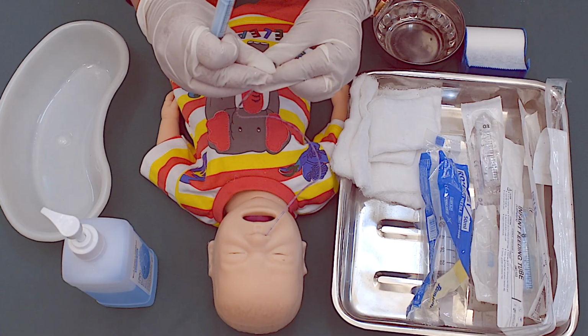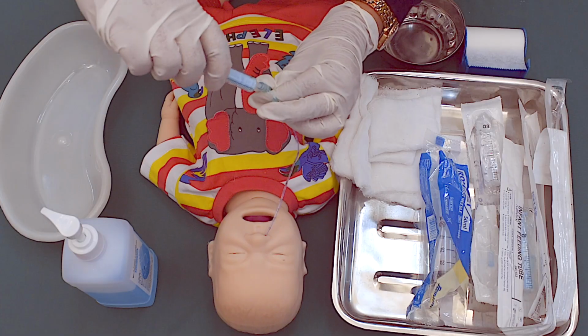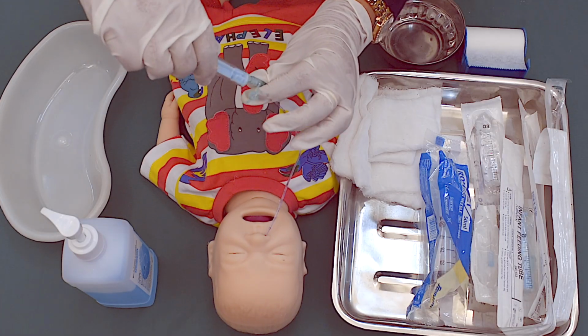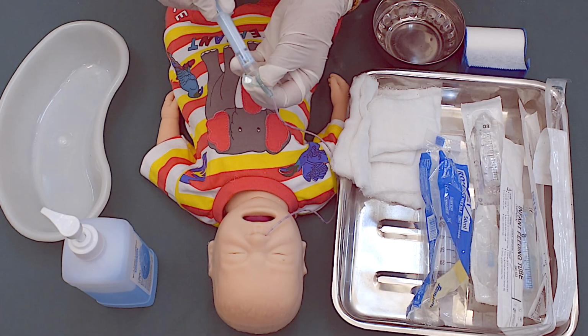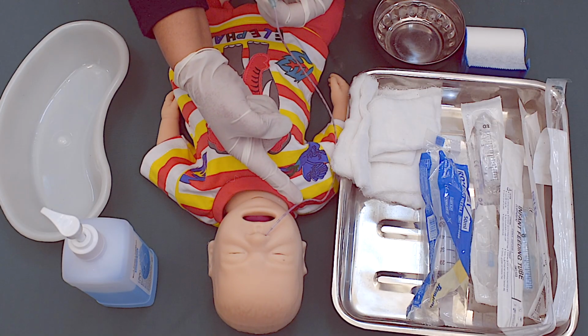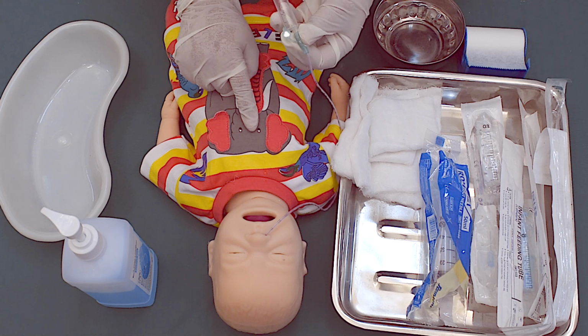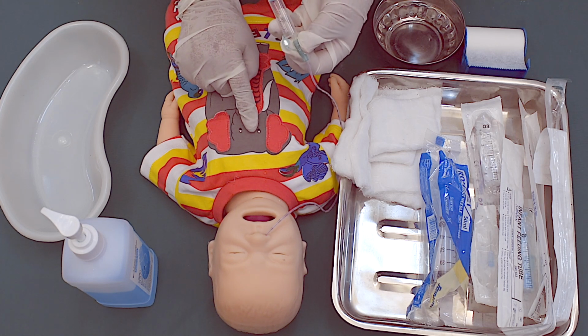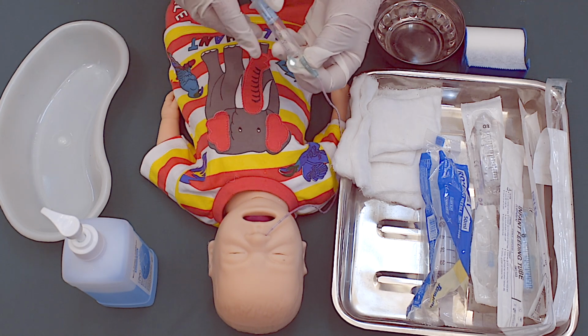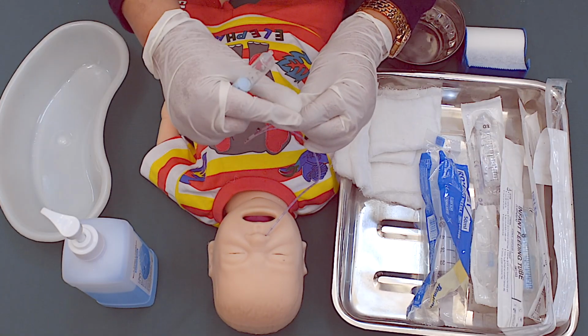Clamp the tube first, open it and try to aspirate the contents. If we see the content rising in the tube, that means the tube is in the stomach of the baby. This tube is correctly placed. Clamp the tube again and disconnect the syringe.